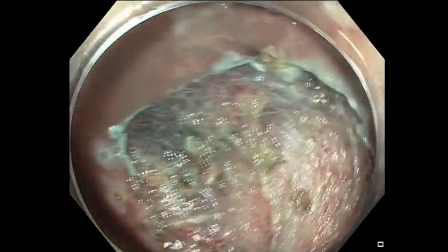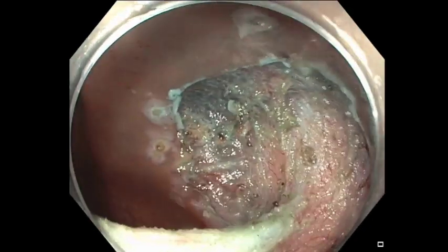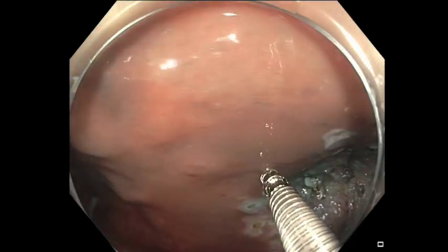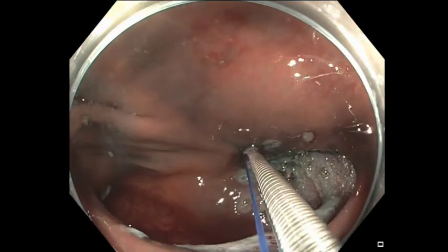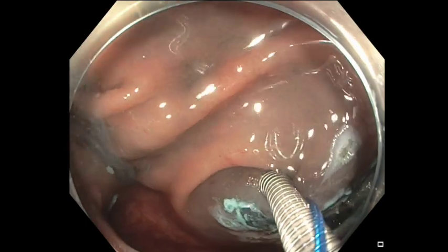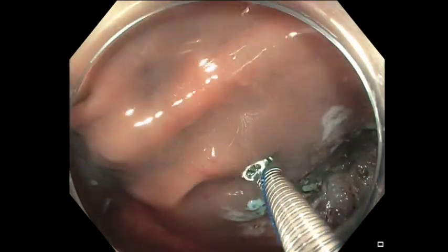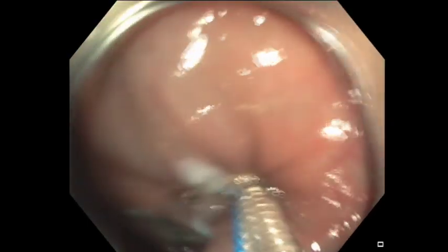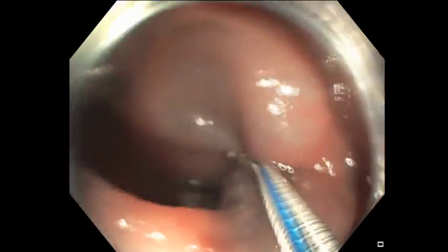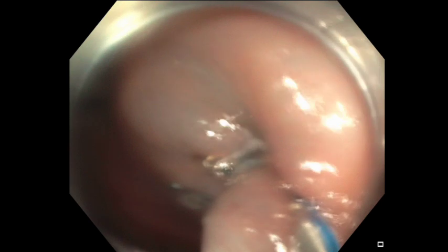And then we reenter, and you see, inspect the lesion, look for any muscle injury. We don't see any muscle injury here, although this lesion is in a fold. Close versus no close. Since there's no muscle injury, you might leave this lesion without closure. However, for larger areas, I prefer closure for delayed bleeding, particularly if the patient is taking anticoagulation.